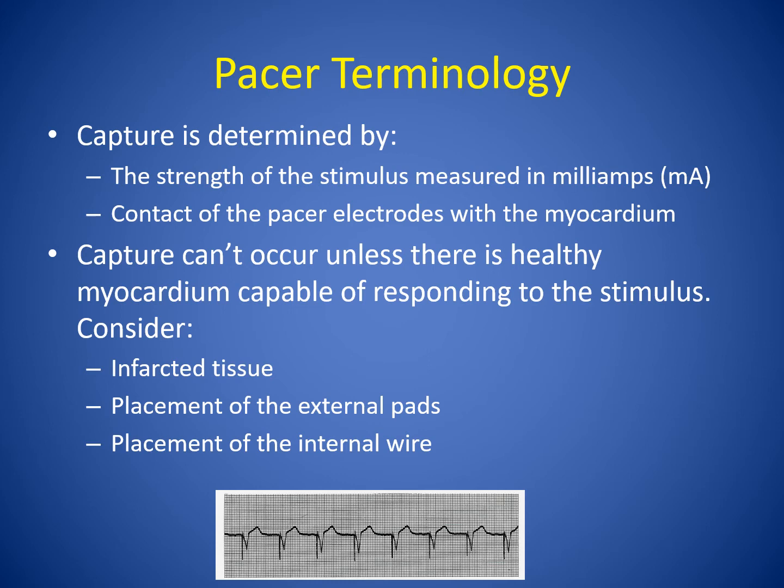Capture can't occur unless there is a healthy myocardium capable of responding to that stimulus. So things like if the patient had an MI, that infarcted tissue cannot be conducted. It doesn't conduct. Sometimes placement of external pads does not always work, especially in some patients that are very large, and sometimes placement with an internal wire. So these are things that may show that the patient's pacer is on, but it's not actually capturing.